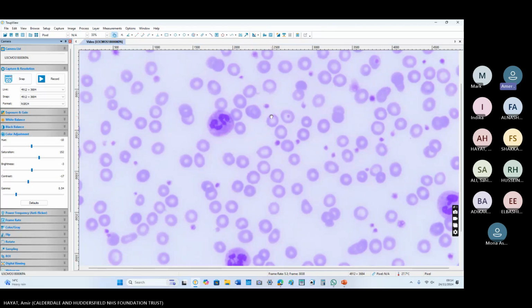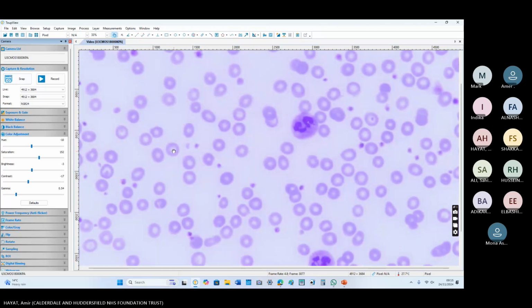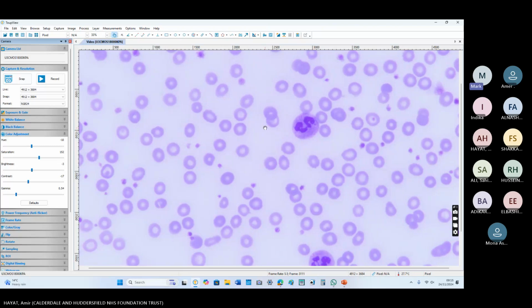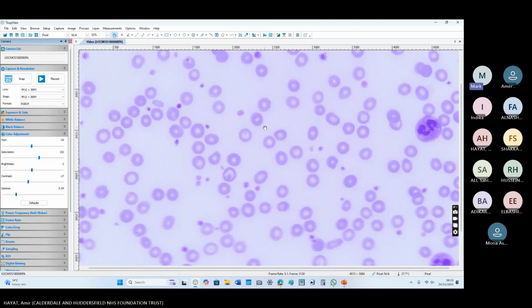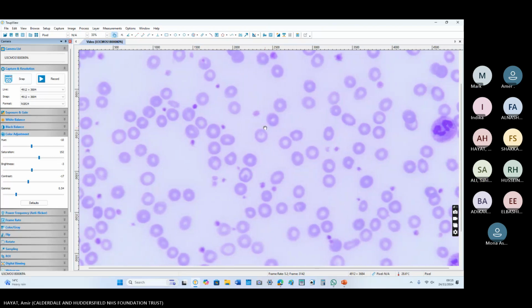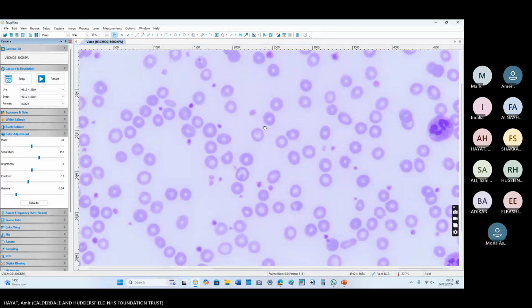There is a dot here, which means this blood film relates to a female, right? This is a Barr body, yeah, if I remember correctly. You sometimes see Döhle bodies as well here. What happened? Sorry. No, sometimes, sorry, I'm asking about this. Sorry, carry on.